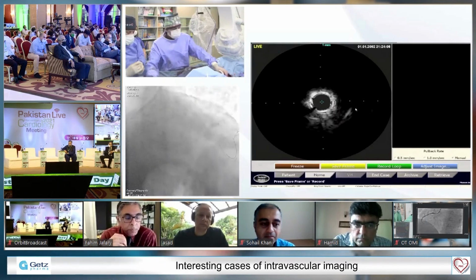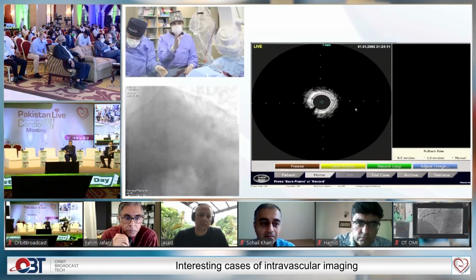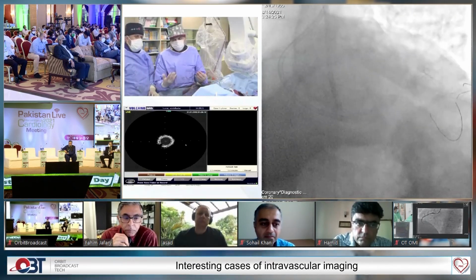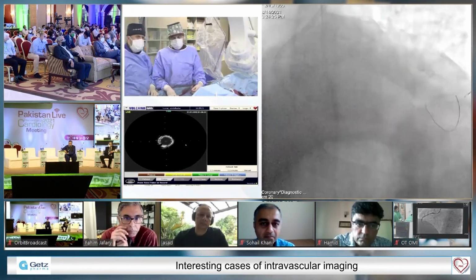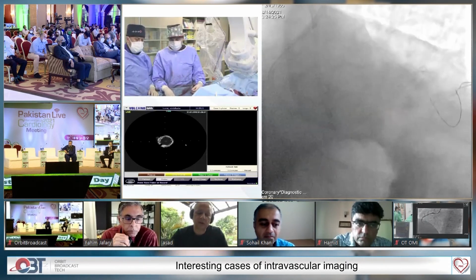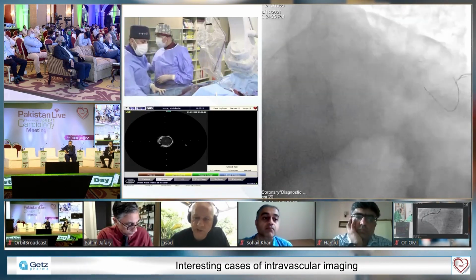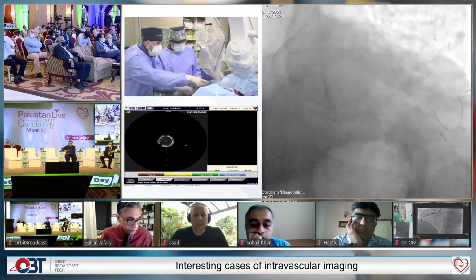You see that? Yes. And also you see that I have a good plaque burden at the edge of the proximal stent, proximal part. So that's also, to me, kind of a risk for restenosis. Okay, but we have to size it, right, first? So just to reinforce what Omar just said, in an ideal world, you would want less than 50% plaque burden at both ends of the stent. So, okay. Remove this wire and work as one guide.